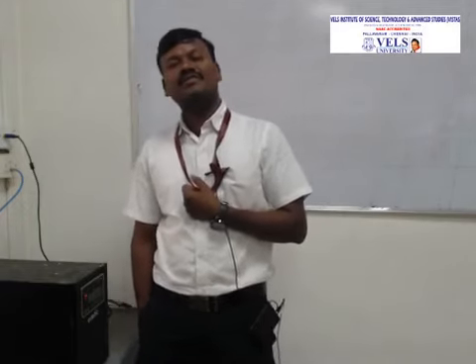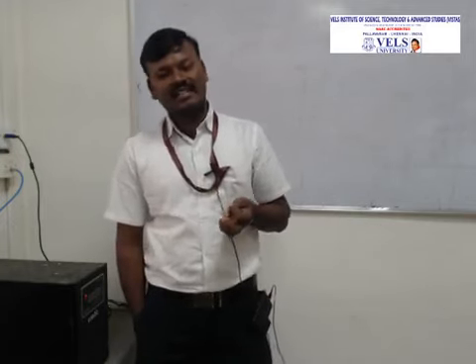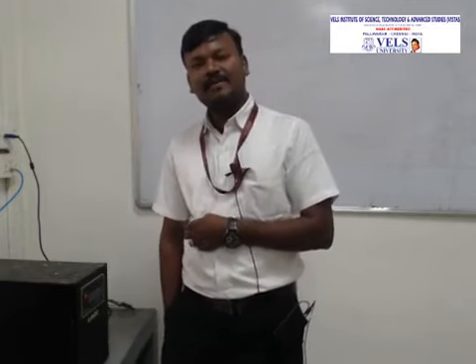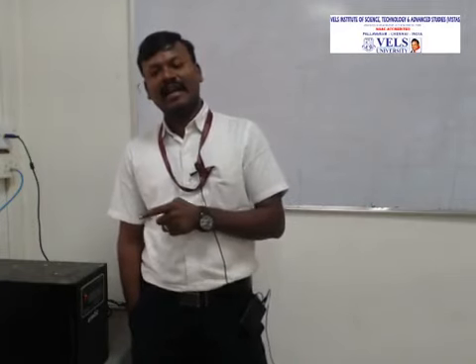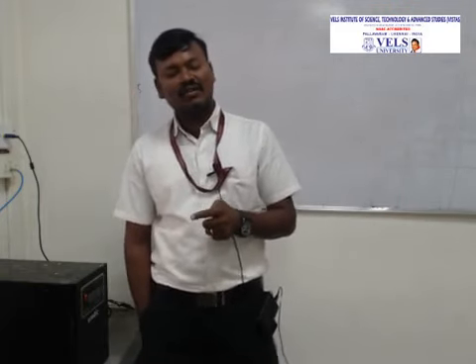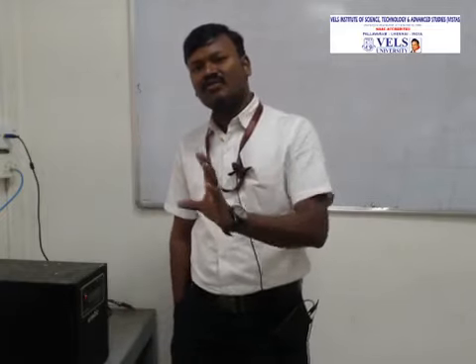For the procedure of chemical hatching, a fine micropipette containing acidic Tyrode's solution is brought very close to the zona pellucida region, and the acidic solution is expelled gently over a small area at a distance of 20 to 30 micrometers, until the zona is dissolved, because we are only targeting the zona pellucida.